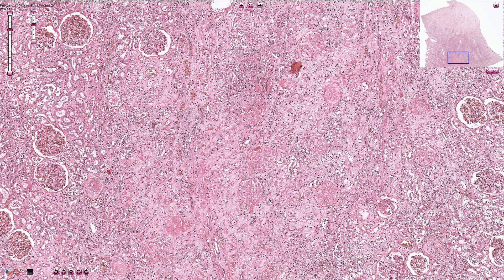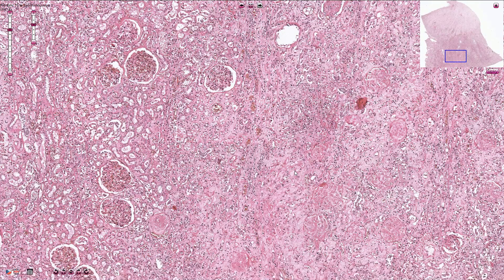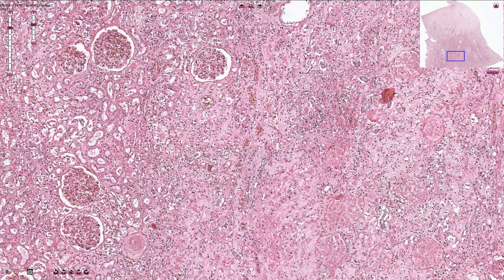Here we have the border between the viable parenchyma on the left side and the necrotic ischemic parenchyma in the center. We can compare these normal viable glomeruli and renal tubules with these sclerotic ischemic shadow-like glomeruli and completely degenerated renal tubules.